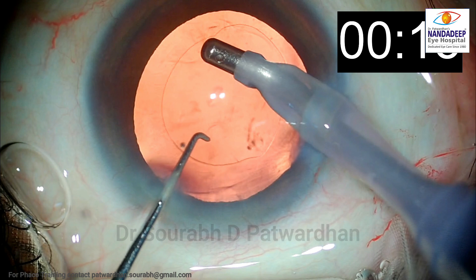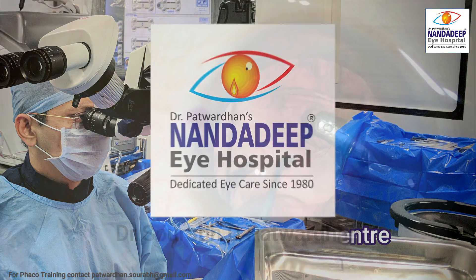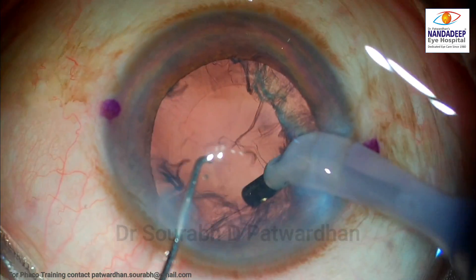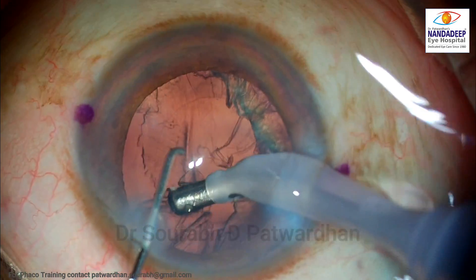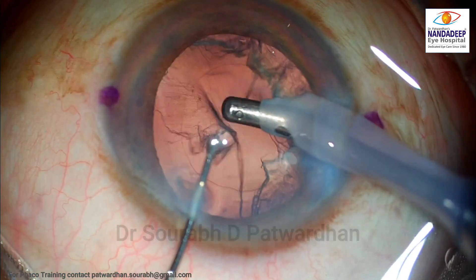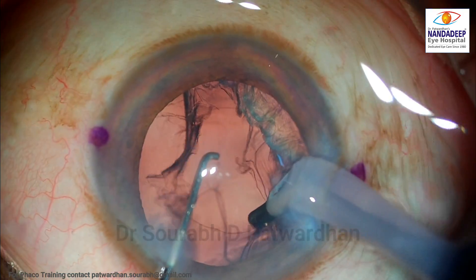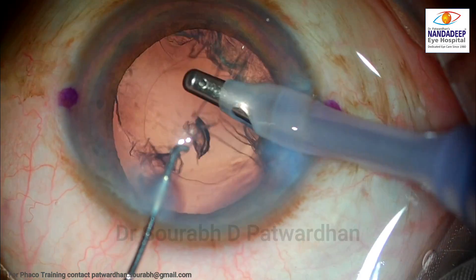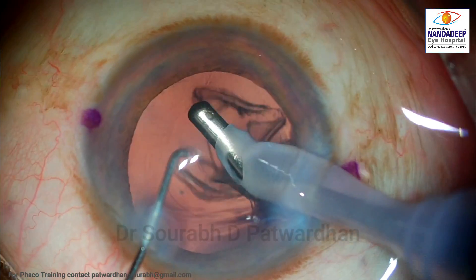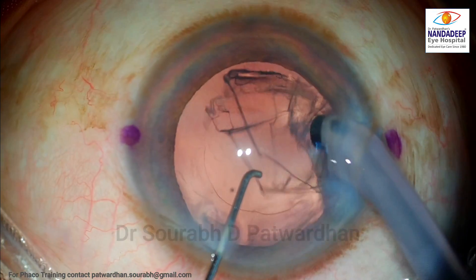These are the proper steps to follow in every surgery to have very safe and repeatable cortex aspiration using the coaxial IA. Now let us look at this next case. The same rules apply — catching hold of the cortex with low vacuum, engaging it, pulling it towards the center so that it gets released from the equator, and then using the full vacuum with the opening of the IA tip pointing anteriorly.